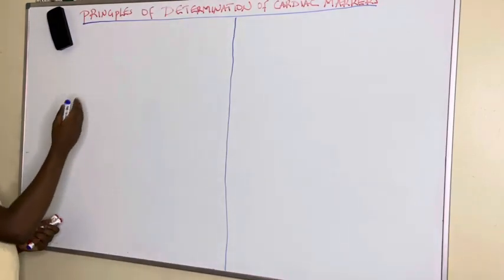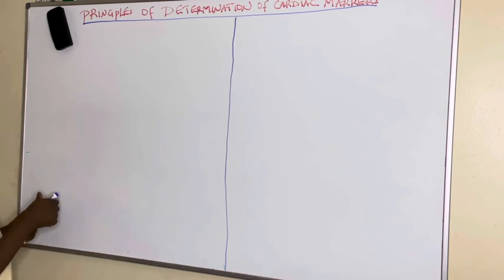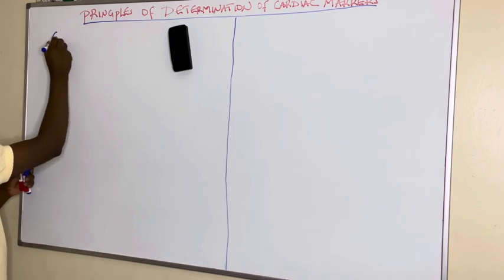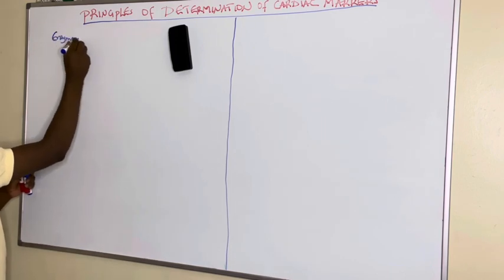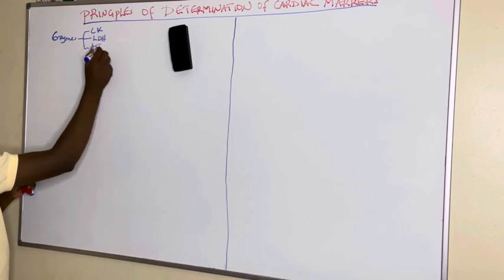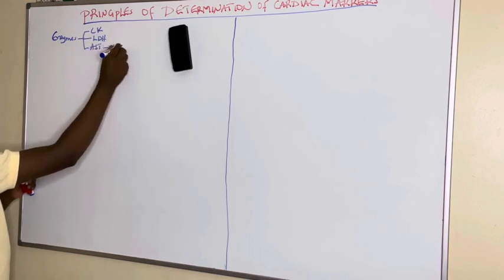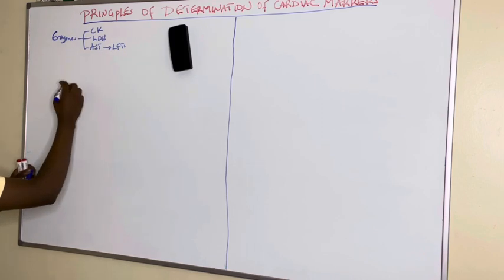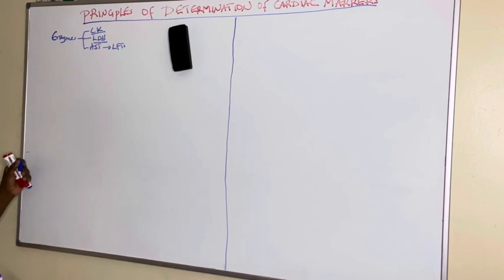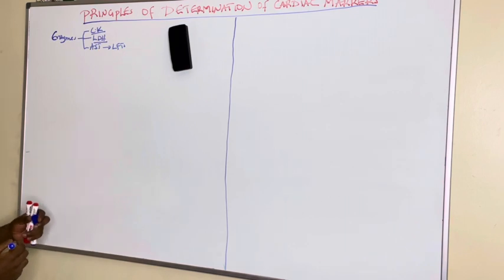Among the cardiac markers we listed in the previous video, we saw there are those which are enzymes. And among the enzymes, we listed total CK, which comprises different isoenzymes. We looked at LDH, we looked at AST. But AST is already covered under LFTs. So here we shall look at LDH and CK, and specifically, we shall look at the determination of total creatine kinase.